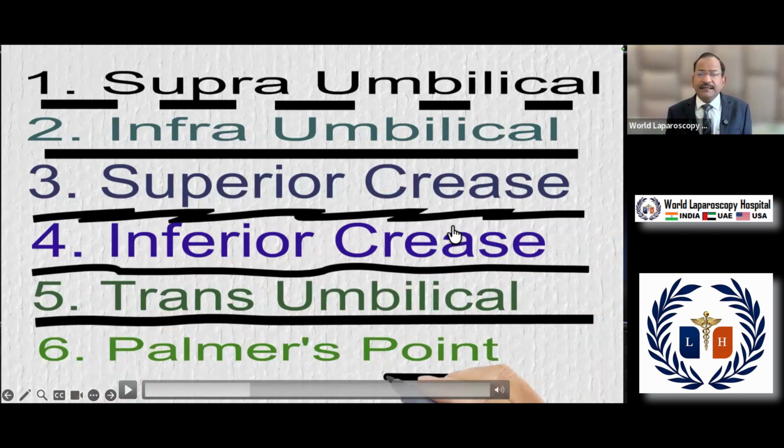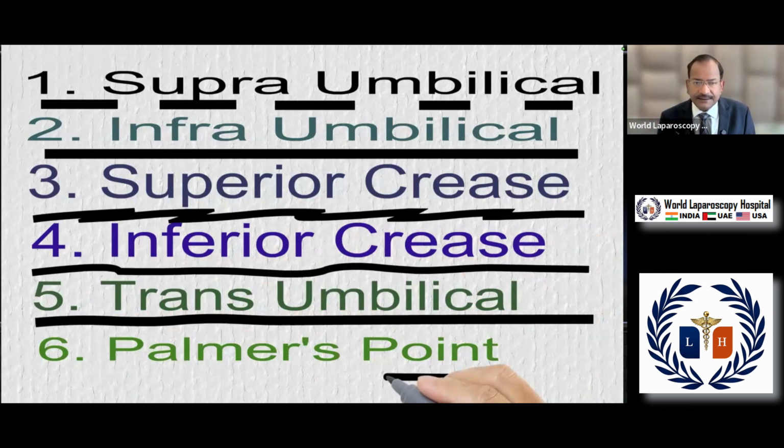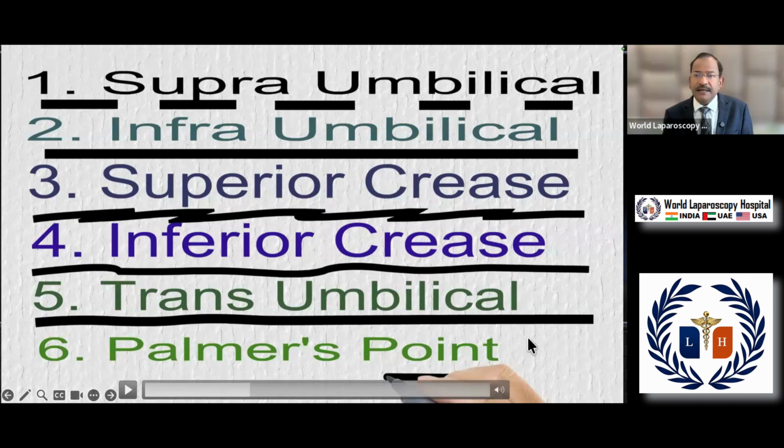These are the only 6 sites of the optics. There is no 7th site. When you want to put the telescope in laparoscopy, these are the only 6 sites where you will use. There is no 7th site available for laparoscopy.